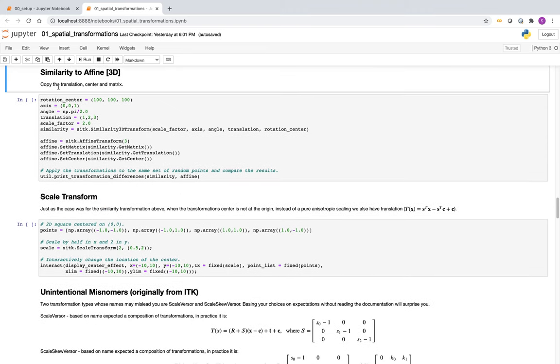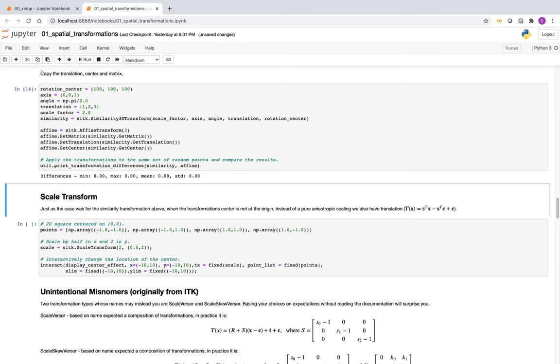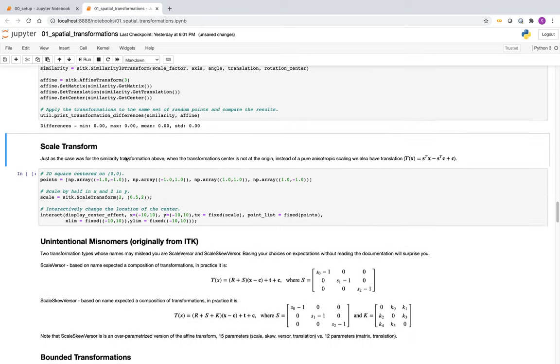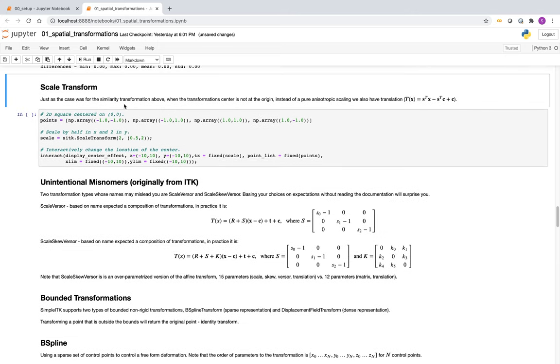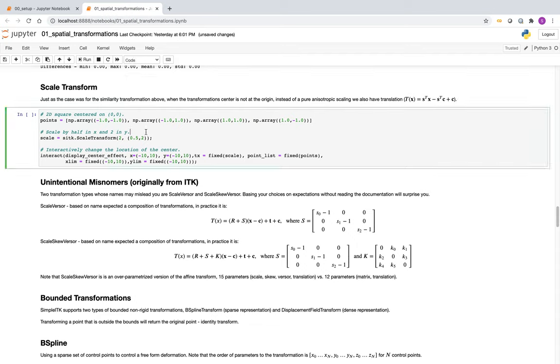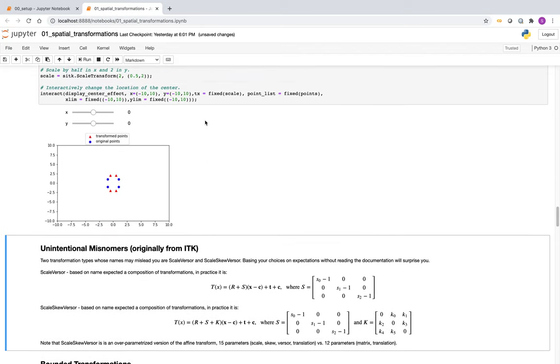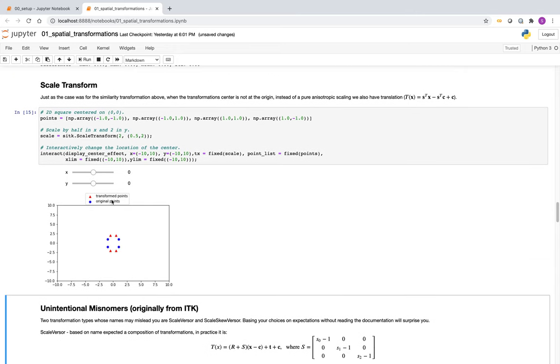Moving from similarity to affine, you need to copy the translation, center, and matrix. Create a similarity transformation with axis-angle, translation, and scale factor, then get the matrix, translation, and center from it to set up your affine transformation. For the scale transform, similar to similarity, there is an unintended effect due to the center transform — this is non-isotropic scaling, and changing the center of the matrix produces an effect that looks like translation.